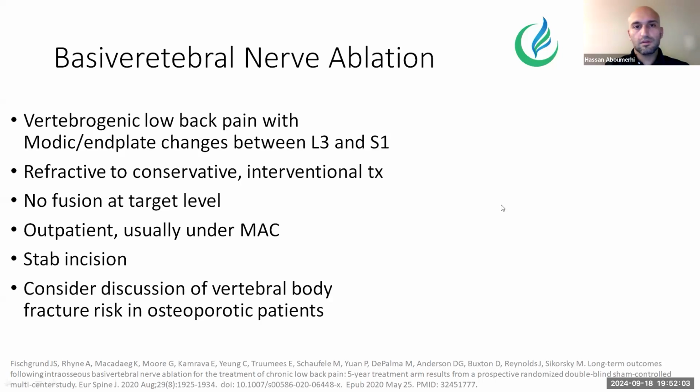So this next one is basivertebral nerve ablation. This procedure is really cool in that it's able to treat a more unique diagnosis of vertebrogenic low back pain, and that's pain that comes from chronic discogenic back pain. As the disc degenerates, you end up getting this persistent vague back pain.